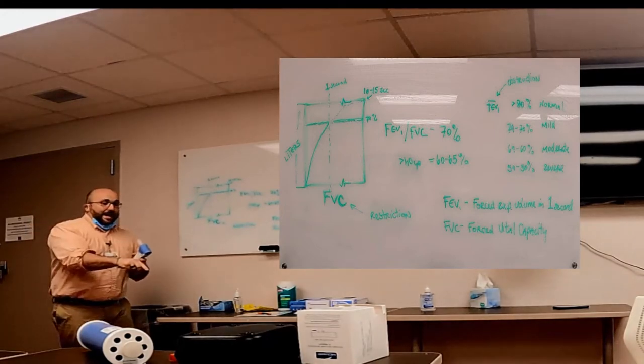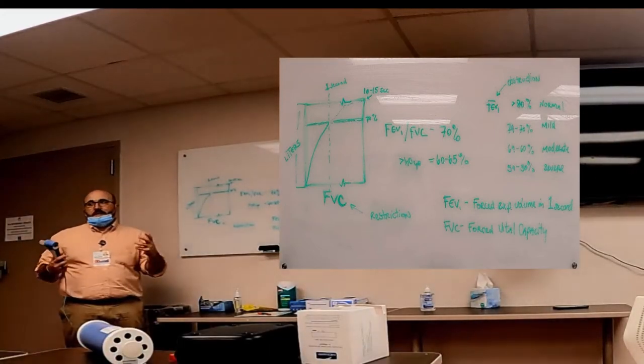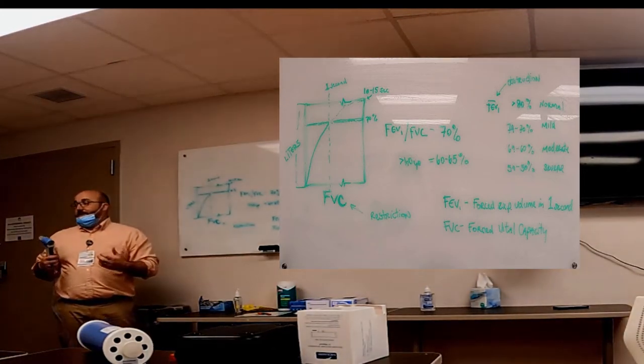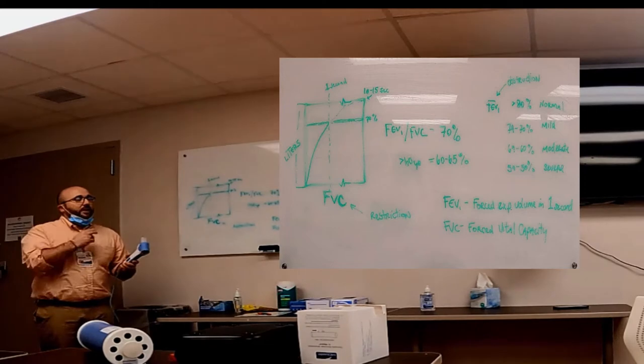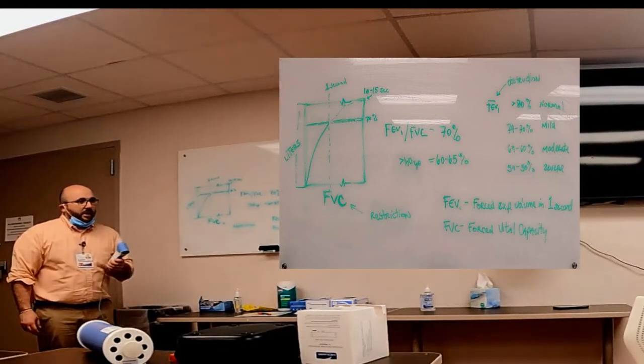And then it's blast every bit of air out, because it needs to be 10, really needs to be 15 seconds. We're going to say 10 to 15. 10 to 15 seconds of exhalation for it to be an adequate test. So what we're going to look at, it'll look something like this. So I'll try to count to make sure I get it all in. So it asked me to take my big deep breath and blast it out.